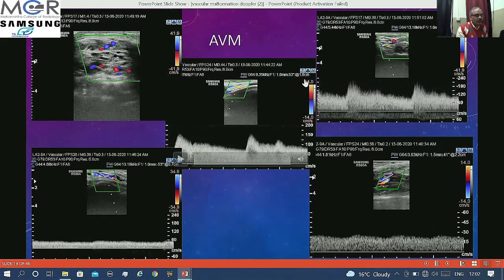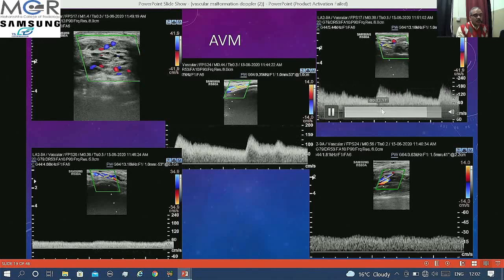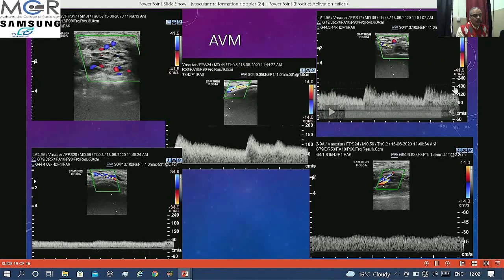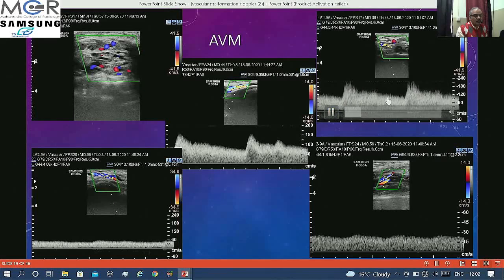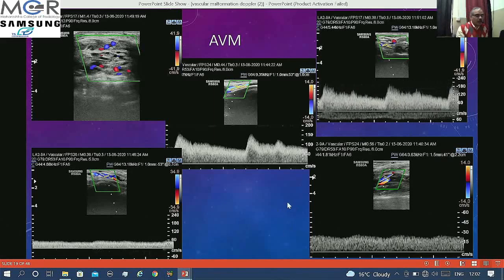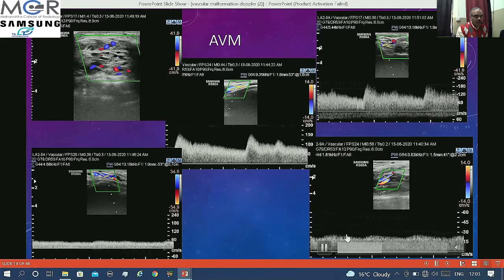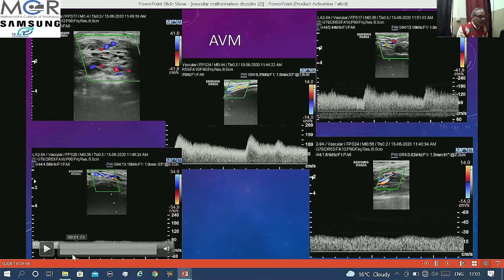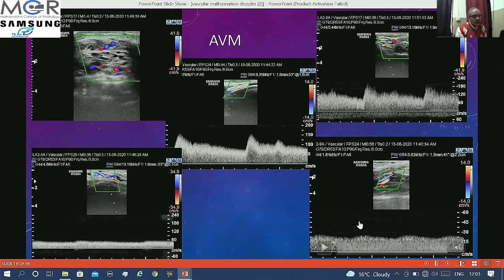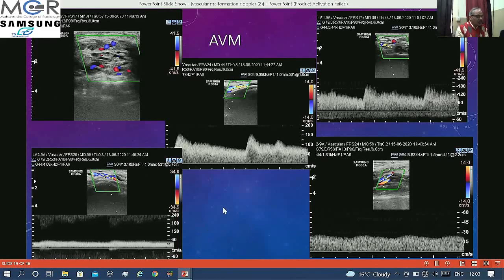With PRF increased from 14 to 41, very high flow is still seen — more than 180 cm/s systolic and more than 120 cm/s diastolic. The turbulence at the site of aliasing represents the AV communication. The feathery appearance of the spectrum is what you should always look for when identifying AV communication. The draining vein shows arterialization of flow — loss of phasicity, continuous flow with an arterial waveform — similar to flow seen in the umbilical vein in severe ischemic changes.